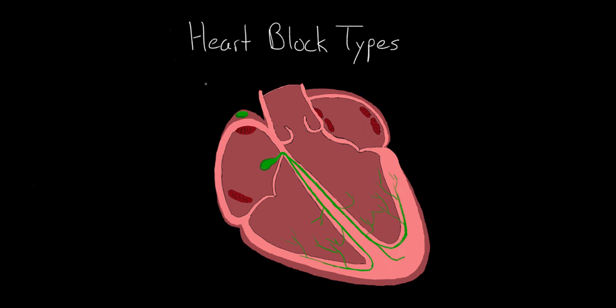Now we know that a heart block is a disruption of the electrical system of the heart, and we also know that an electrocardiogram can be used to diagnose it. Well, an electrocardiogram can also give us information about where in the electric system the problem is.